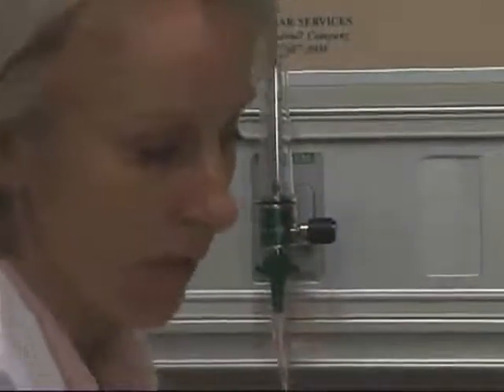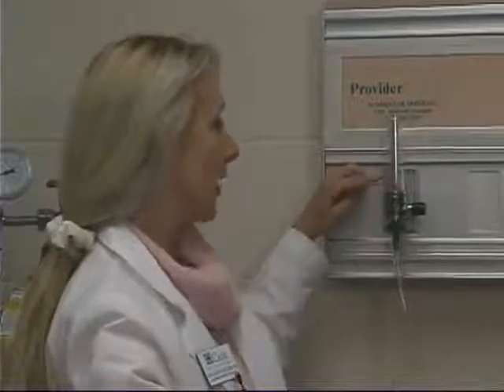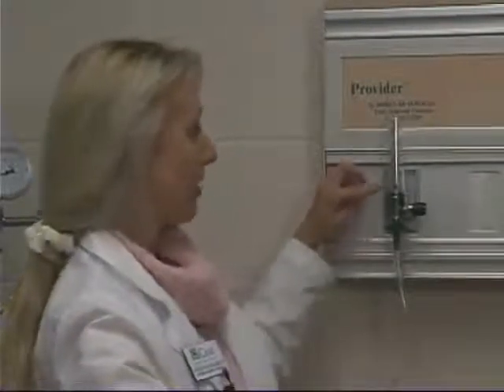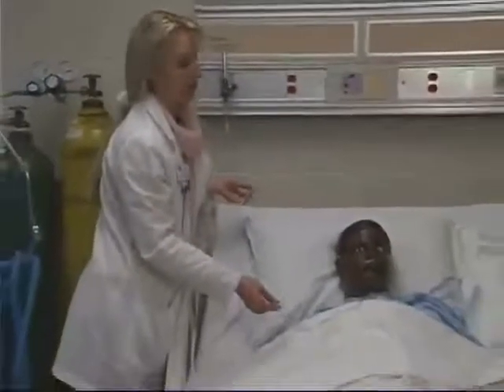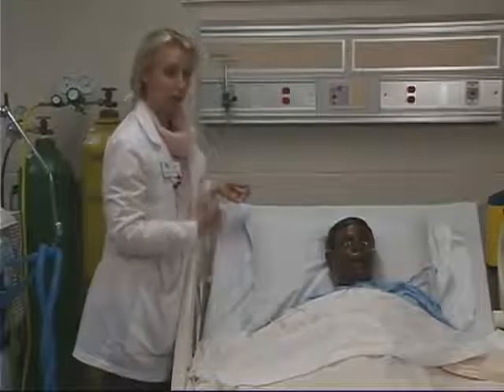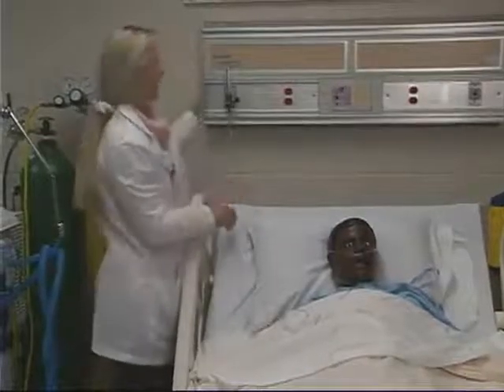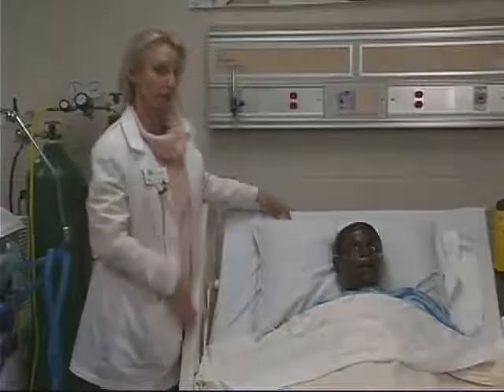Room air is approximately 21% oxygen. For every increment of one on this flow meter, you're adding approximately 3% of oxygen to room air. So for example, if you have this on one liter per minute, that will correspond to approximately 24 to 28% oxygen. That's not necessarily how much oxygen the patient is breathing — that's only one of three components. The other two are how fast the patient is breathing and how deep the patient is breathing. The rate, the depth of respirations, and the amount of oxygen you're delivering all three determine the range of inspired oxygen the patient is actually getting.